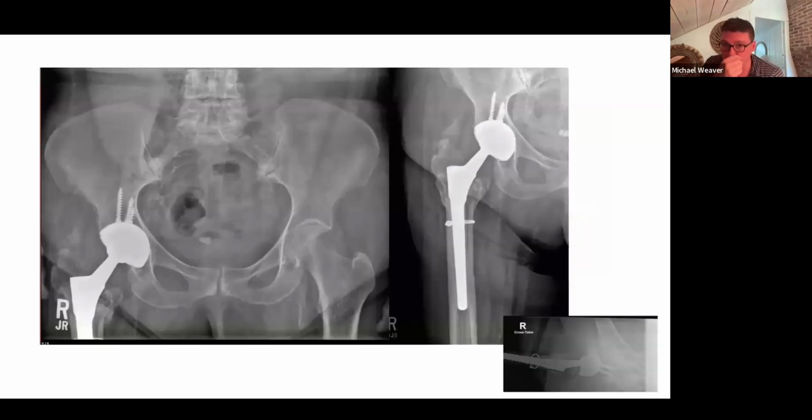And so this is the final result with that. Again, you can see the proximal geometry is as small as you can be. There's no big bulky body there to ream out the greater trochanter, and so it works out quite nicely.